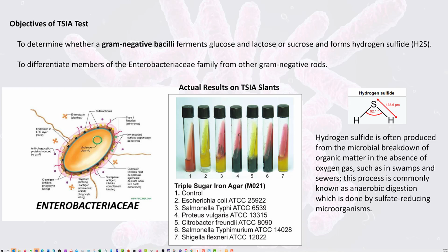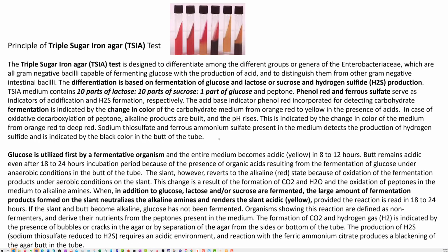So we have all these different determinations, but look, we can identify a series of microorganisms using a test like this, the gram negatives. And again, this is for the gram negatives, and of course it's part of the Enterobacteriaceae group, and we look for as many of the pathogenic traits as we can, depending on if we can identify it. But if we can't, we just use a simple triple sugar iron agar test to help identify it. So I have here, so you can read through the slides, the write-up of what's actually going on. I've highlighted in black some of the key parts.